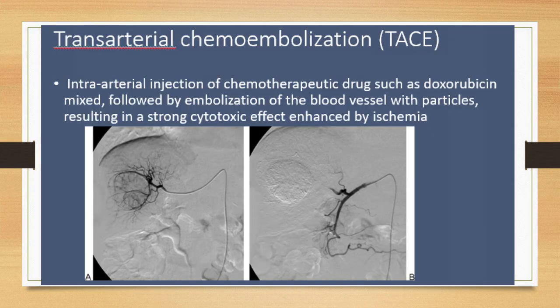Okay, so the first one I wanted to talk about is transarterial chemoembolization. This has been getting done for a while, but more and more. Let me orient you to this picture because it looks like a spider, but this is from an interventional, so like a cath lab. If you've ever had a coronary cath, this is how the images look when they're doing it. This is the radiologist's catheter, and it's going into the hepatic artery here. So see how this all kind of lights up.